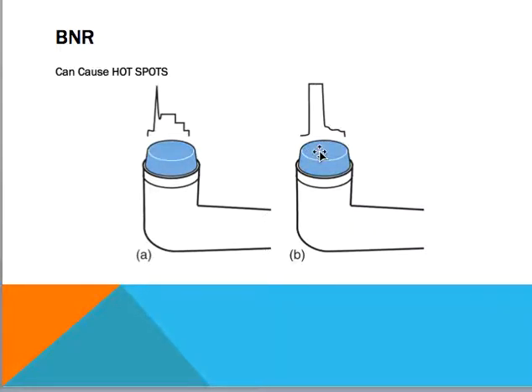Now, what if somebody complains of pain when you're giving the ultrasound, which should not happen, but if it does, what are some things that you could do? You could move the ultrasound head faster so this hot spot isn't directly at one point. That's one option. You can decrease the intensity. If you do that, though, you need to make sure that you increase the time of the treatment.